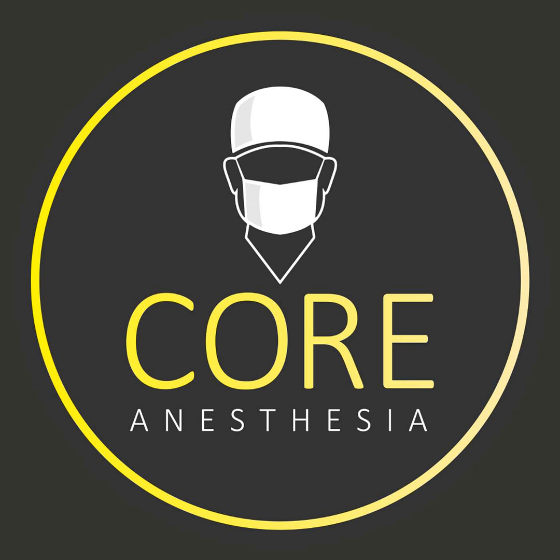So basically what you're going to do when you're getting down to that space is you're going to see the epiglottis that is hanging down in your view. The blade is going to go just above that, and there's a little space there. That's what's called the vallecula. And then actually applying pressure there is going to help that epiglottis flip up out of the way, and that's what's going to give you your view. With the Miller, in contrast, you're going to actually lift up the epiglottis with the blade, and that's going to give you the direct view to the vocal cords.